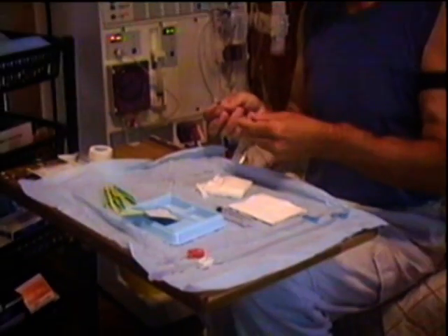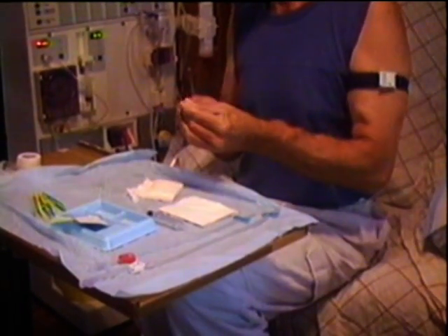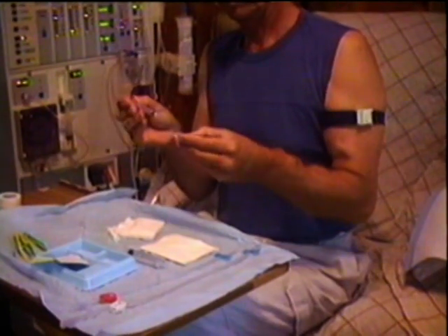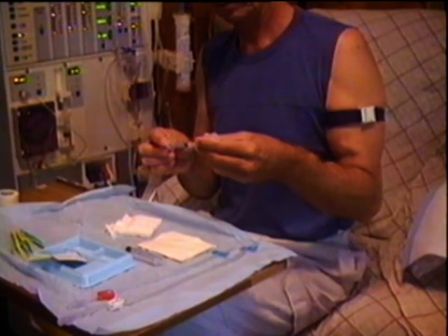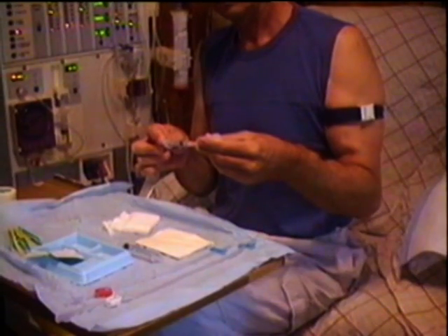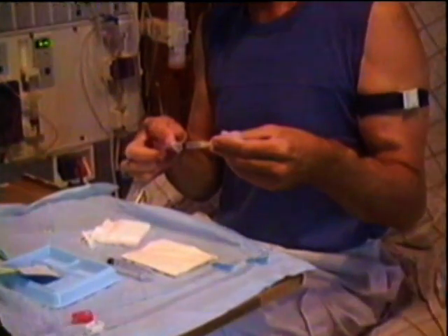Now of course I'm a big chicken and I don't like sticking needles in my arm. I'm feeling the pain of those big ones going in, so I'd like to give myself a local, which everybody does here in New South Wales. I'll get some of this into a small needle — it's a 2.5ml syringe with a 25-gauge needle, which is a very fine needle.